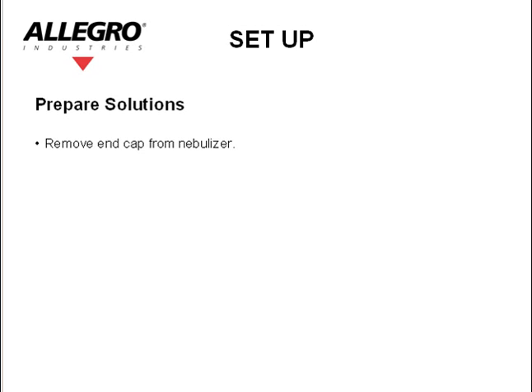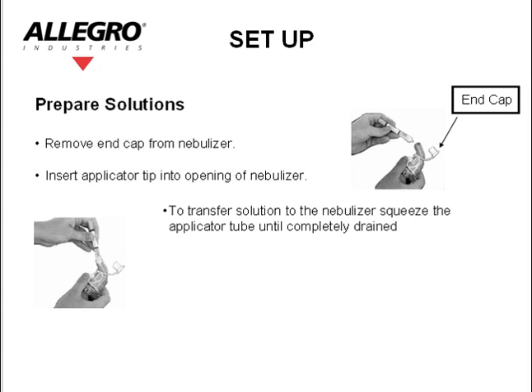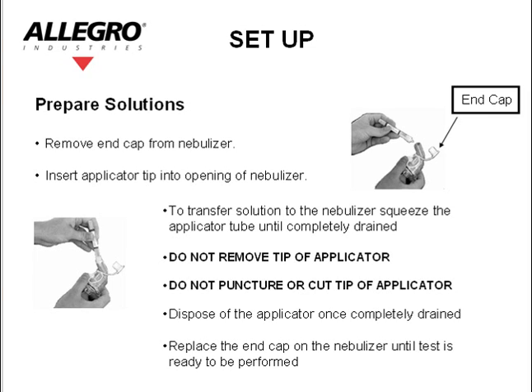Remove the end cap from the nebulizer. Insert the applicator tip into the opening of the nebulizer. To transfer the solution to the nebulizer, squeeze the applicator tube until it is completely drained. Do not remove the tip of the applicator. Do not puncture or cut the tip of the applicator. Dispose of the applicator once completely drained. Replace the end cap on the nebulizer until the test is ready to be performed.